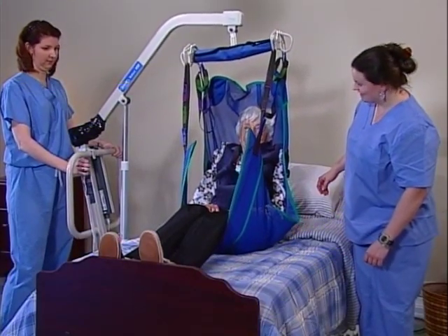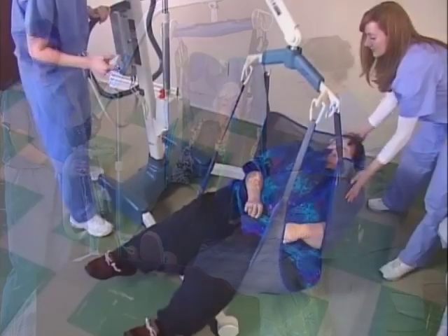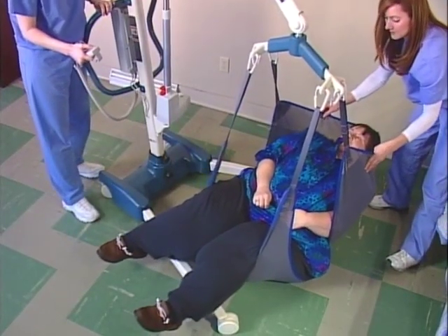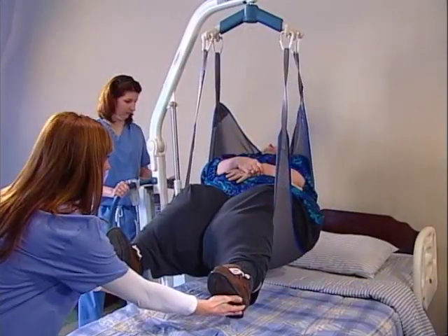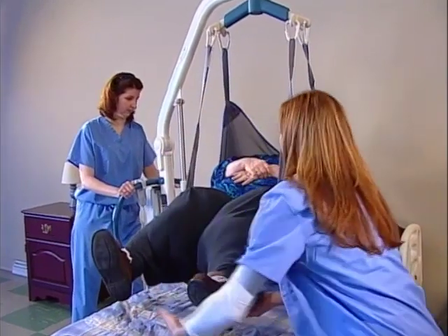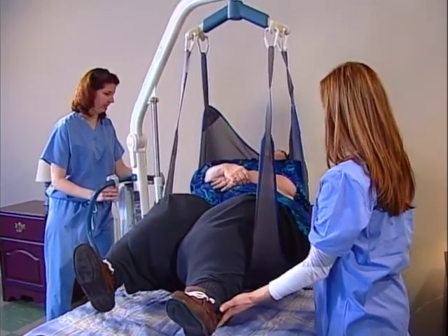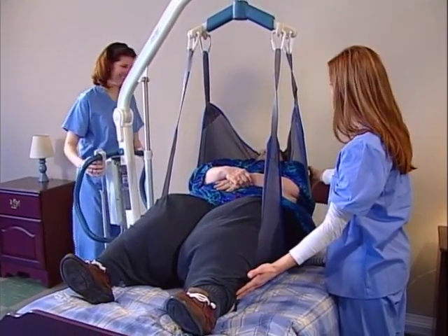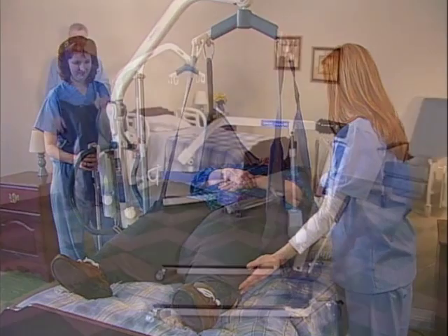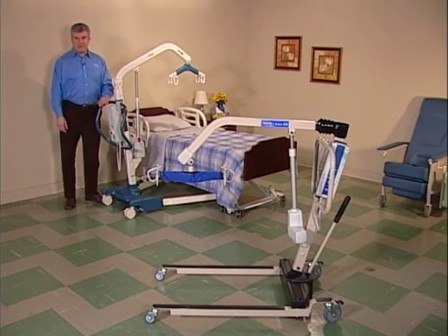Invacare's Jasmine and Reliant Series Full Body Lifts are valuable tools for lifting and transferring non-ambulatory, bedridden, or obese patients. These battery-powered designs make it easier to assist any patient within the weight capacity of the equipment. They can lift a person from a bed, a stretcher, a wheelchair, a commode, even the floor. And depending on the model, Invacare lifts can handle patients that weigh up to 600 pounds.